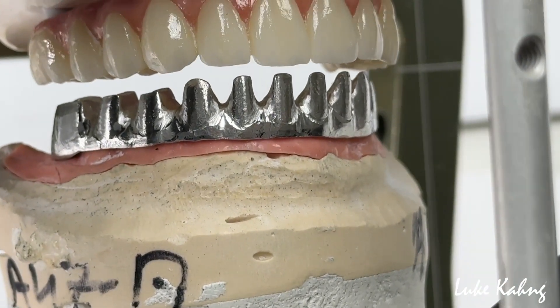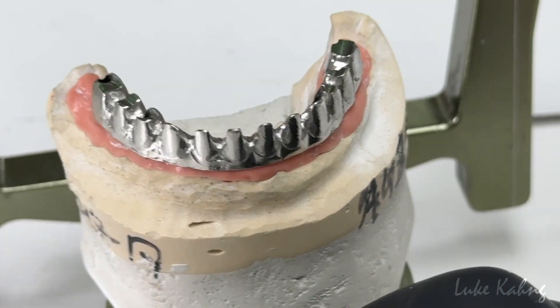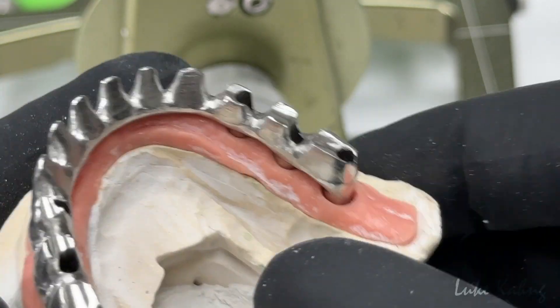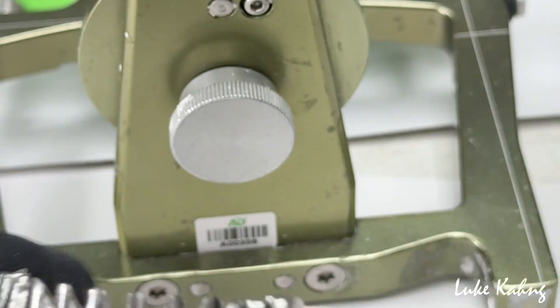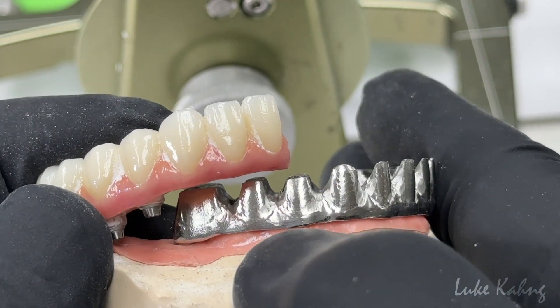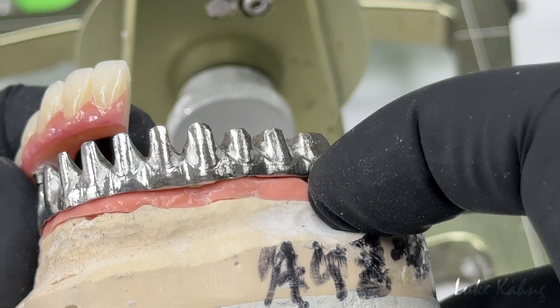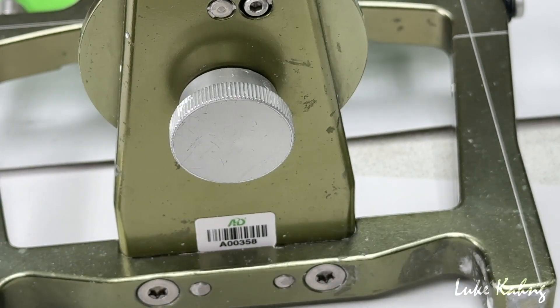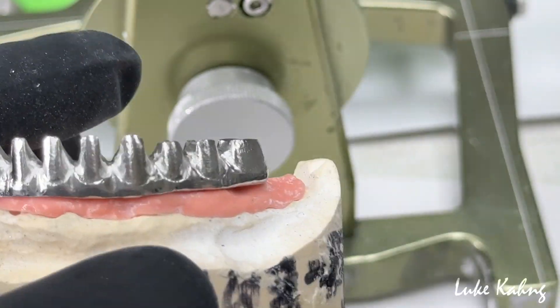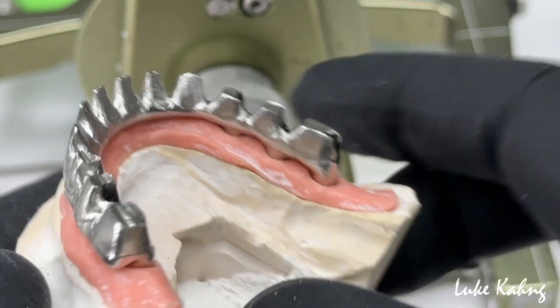And here is the bite — the maximum strength is top and bottom, and I can make this beautiful isolation. We double check with marginal integrity between teeth, trim it a little bit more than underneath here too, make it better. From here to this — and occlusion on it and from there.